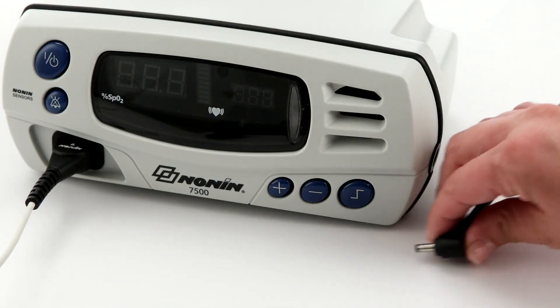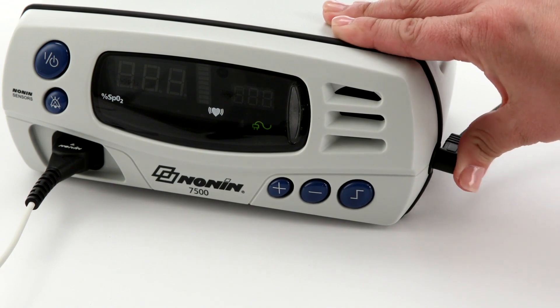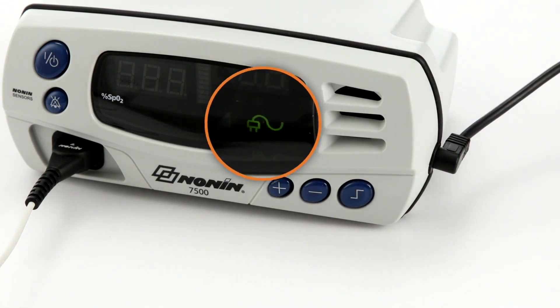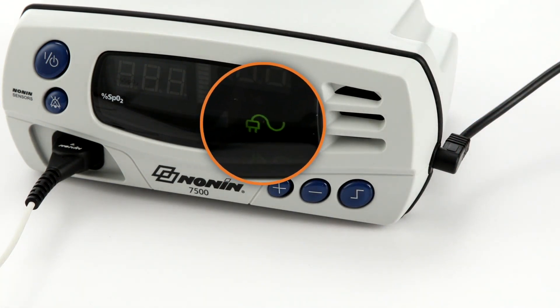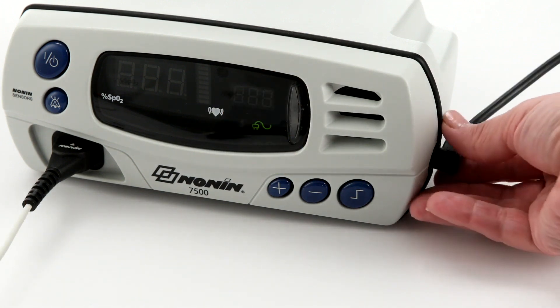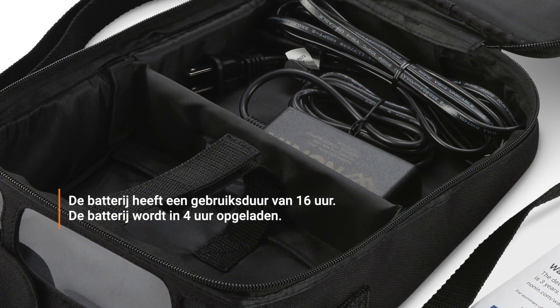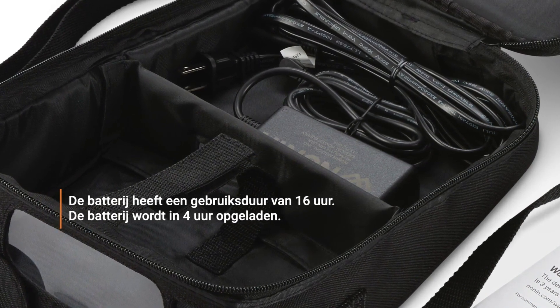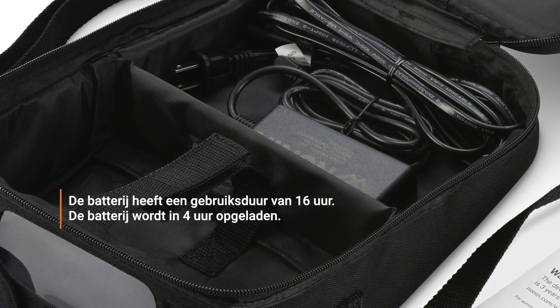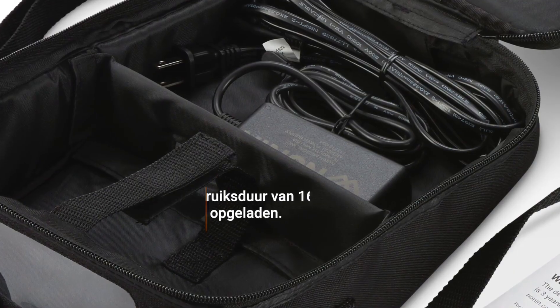The Nonin 7500 can be powered by 100 to 240 volt AC wall power. You will see a plug icon in the display when the oximeter is using external power. The oximeter can also function for at least 16 hours on a fully charged battery pack. The battery recharges when plugged in, whether running or in standby mode.